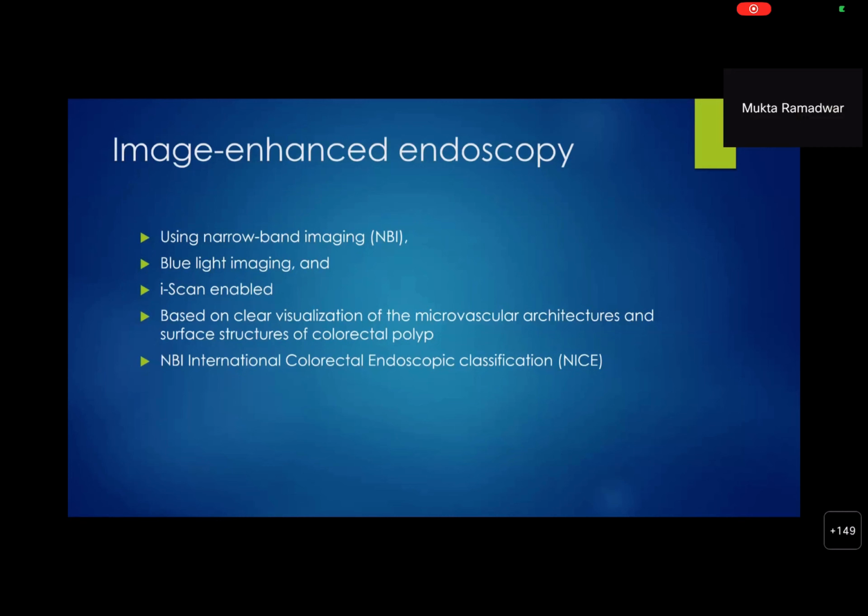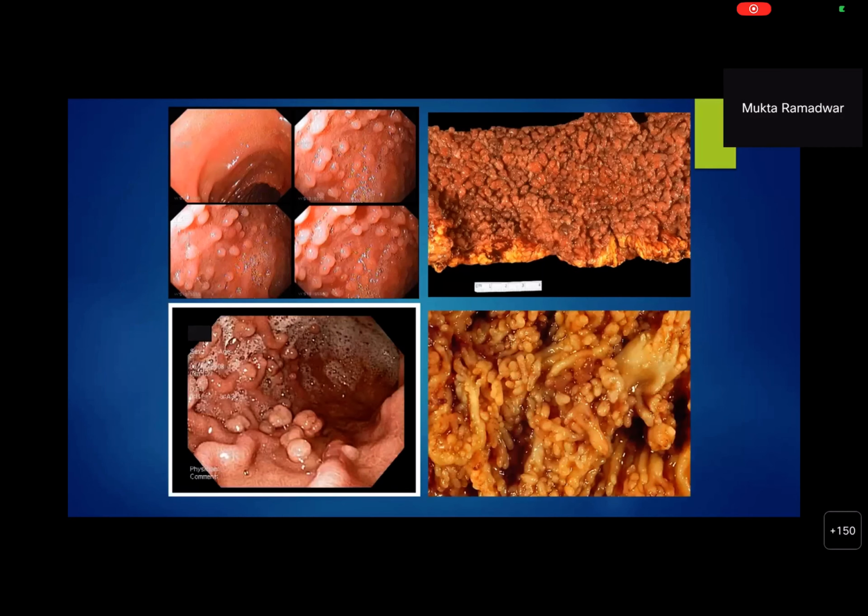Right. Okay. Maybe we can revisit this slide because I'm very sure she would be very quick in diagnosing these conditions. But in spite of that, the fact remains that we have to have the biopsy diagnosis to document the further management of each patient. And remember, this is just an example that I'm giving you to tell you how good the gastroenterologists are getting at the endoscopic diagnosis, but obviously not all patients would have such polyposis, or multiple polyps. There can be just a single polyp which would be given to you for diagnosis.